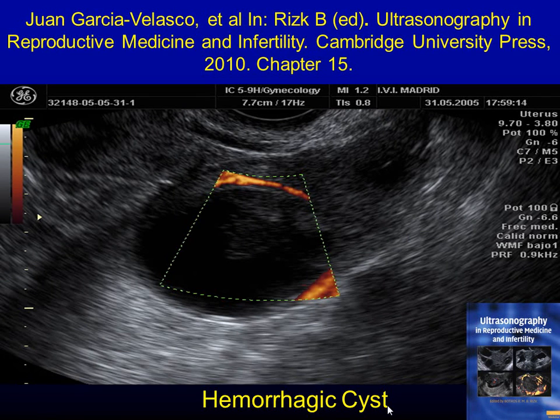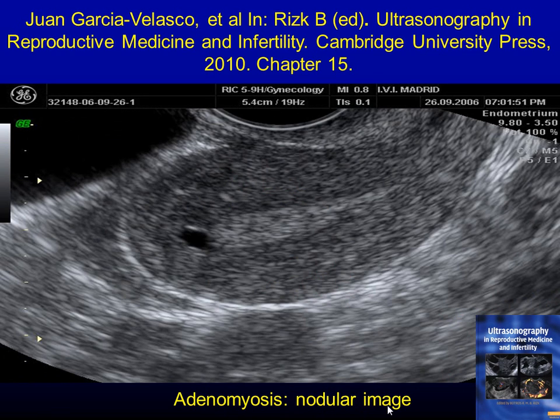Again, a hemorrhagic cyst, when it bleeds inside, and the bleeding happens because of excessive prostaglandin at one point, so it bursts, then you have a little bit of blood inside, and the clot settles, so you have an interface between the liquid blood and the clot. So this is a hemorrhagic cyst. So I've shown you the endometrioma, the dermoid, the hemorrhagic cyst, and then look at that.